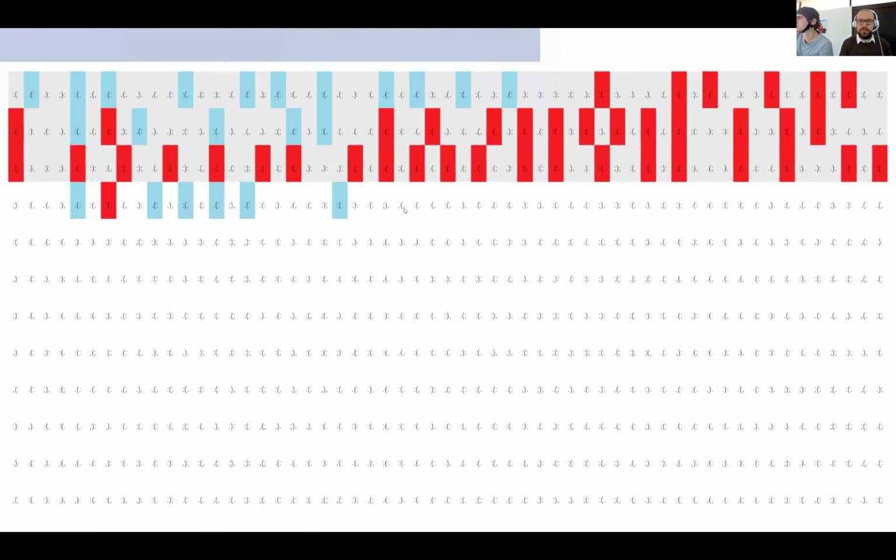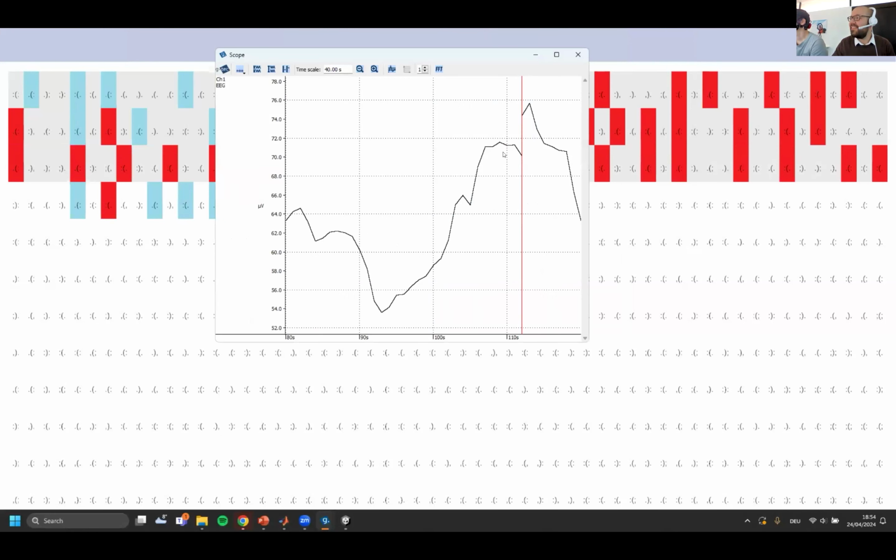Everyone, give me again. Sorry, I have to always stop. And then you can see now the task started, the cognitive load increased. I stopped it, the cognitive load is decreasing. So very good sign, very good sign.